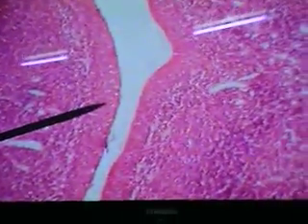And there is the stratified squamous epithelium. Now, sometimes the stratified squamous epithelium is not like what you'd see in the textbook. In most of the slides that we see here, the lymphocytes are literally as if they were just passing through the epithelium.